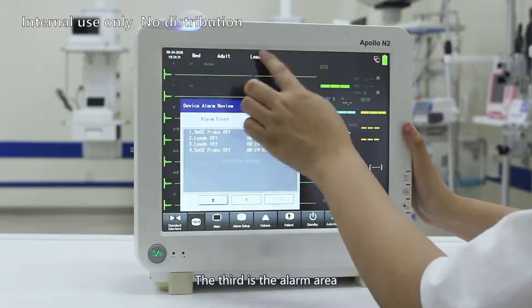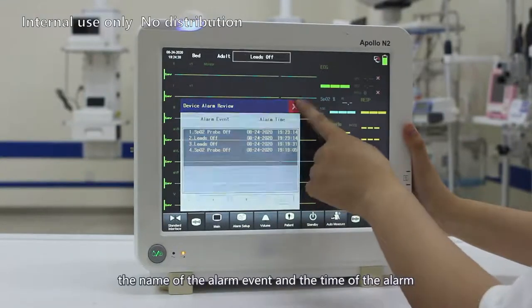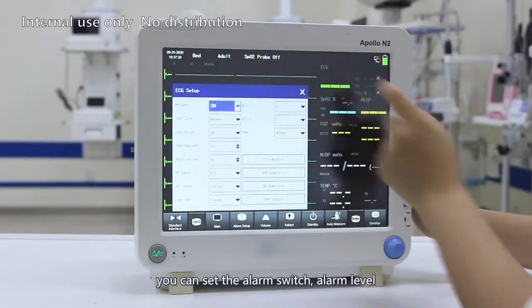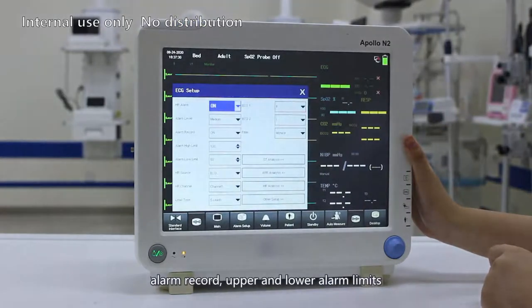The third is the alarm area. It can display the alarm event, the name of the alarm event, and the time of the alarm. Click the ECG setting in the upper right corner. You can set alarm switch, alarm level, alarm record, upper and lower alarm limits.